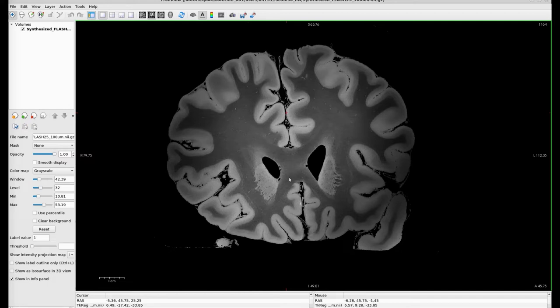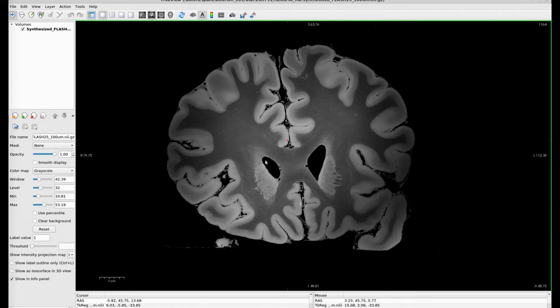We're going to be looking at some of the main structures in the subcortical region of the brain. The first structure I'd like to point out is the caudate, which is part of the striatum and also part of the basal ganglia in the brain. Another structure that's visible here is the lateral ventricle, and this entire region makes up the internal capsule of the brain.